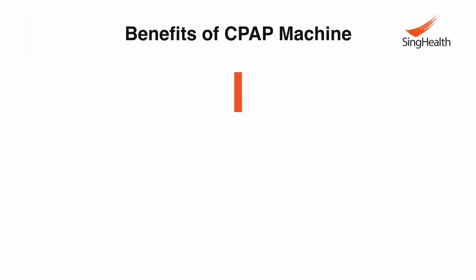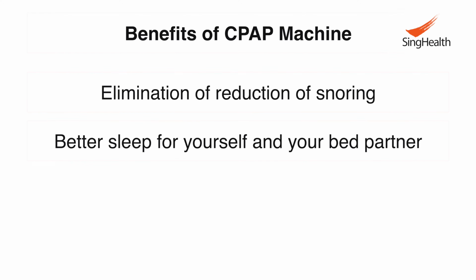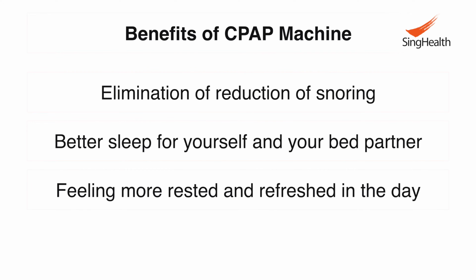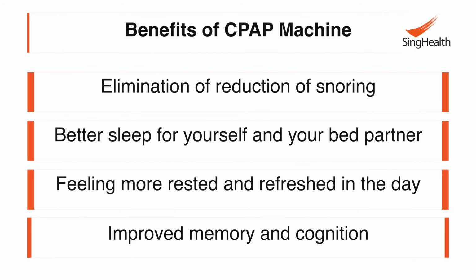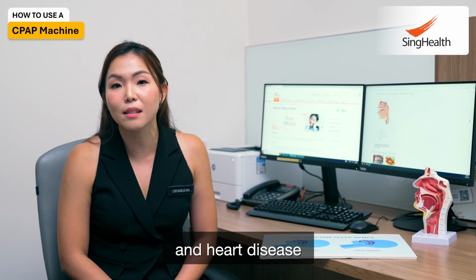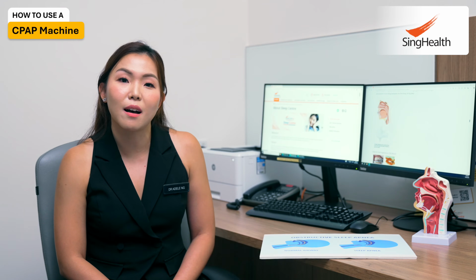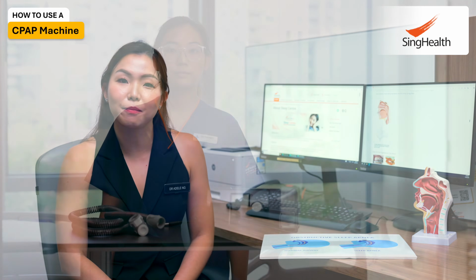Benefits of CPAP include elimination or reduction of snoring, better sleep for yourself and your bed partner, feeling more rested and refreshed in the day, and improved memory and cognition. Consistent use of CPAP also reduces the risk of stroke and heart disease and helps to control your blood pressure. Our sleep technologist Yun Hwee will tell you more about the CPAP machine.